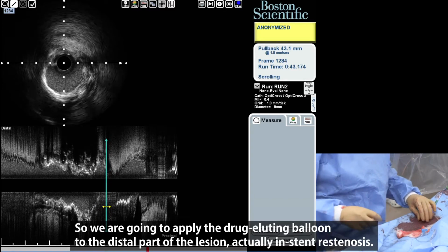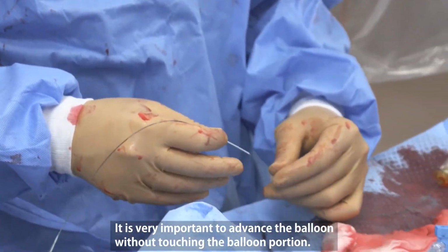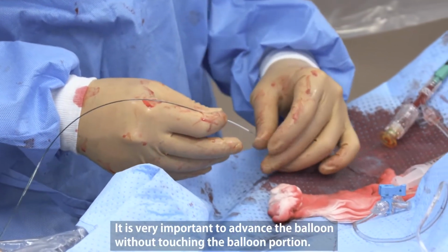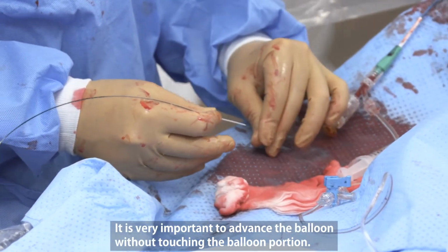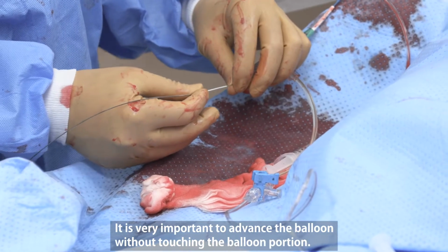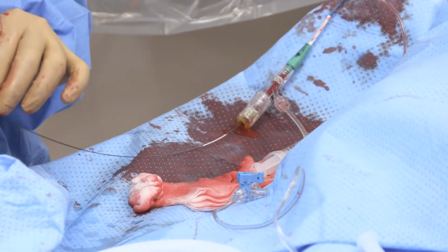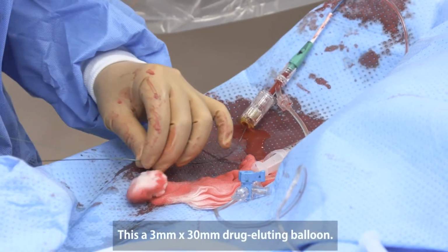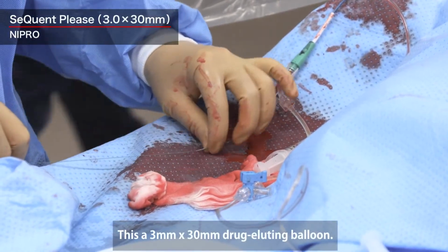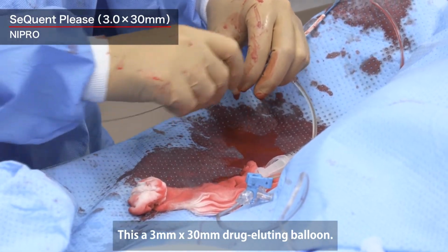Actually, in in-stent restenosis, it is very important to advance the balloon without touching the balloon portion. This is a 3 mm by 30 mm drug-eluting balloon.